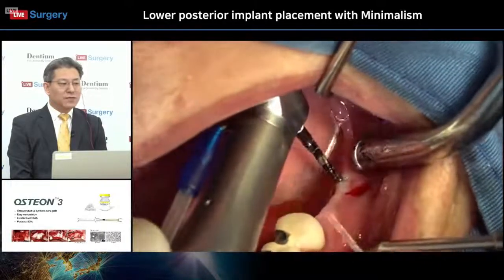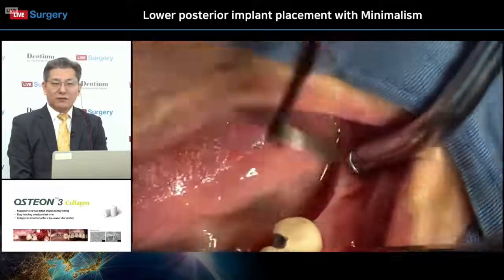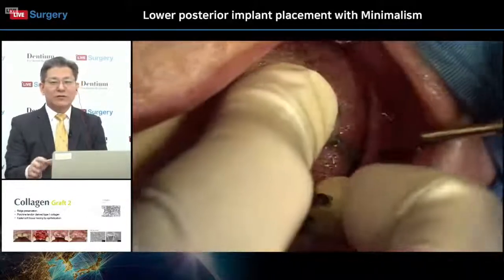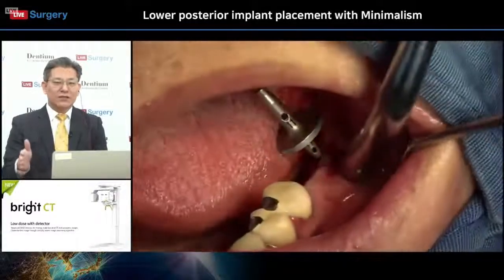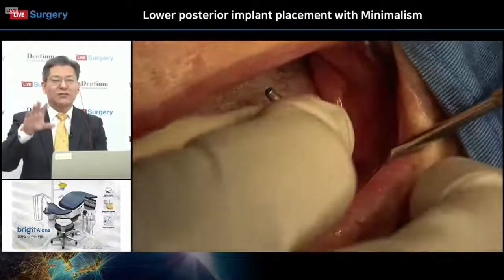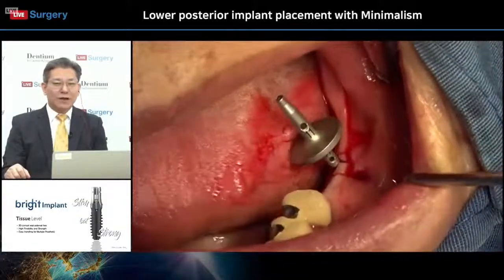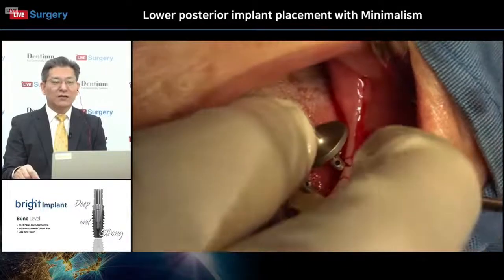All of these procedures start from reading the CBCT. Can you remember that before starting the surgery, I explained each location on the CBCT view? So the shape and nature of the ridge areas should be kept in mind when we have a surgery, especially flapless style, right?